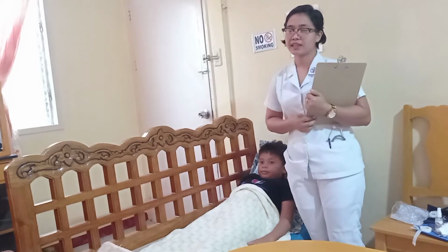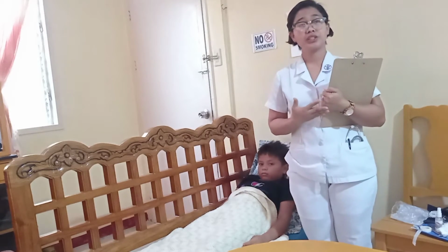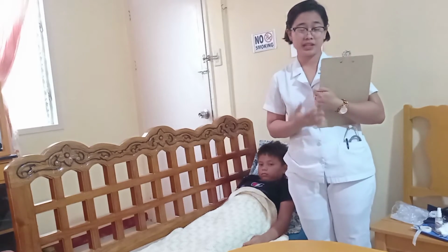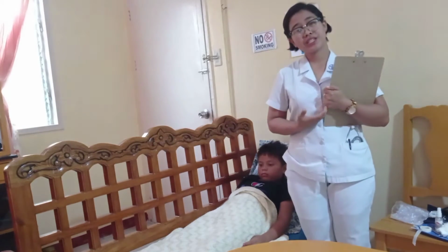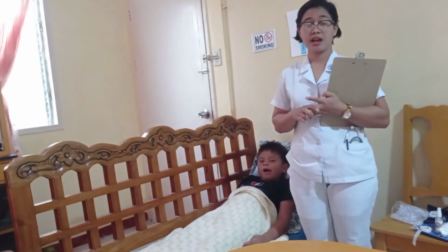Okay, thank you. Oxygen poses a fire risk, so you should never use flammable materials when using oxygen. If you use oxygen tanks, make sure that your tank is secured and stays upright.